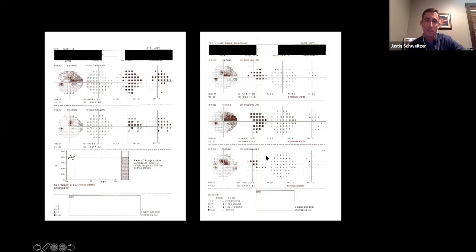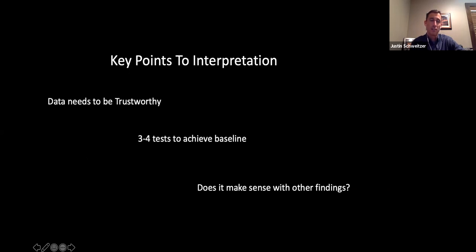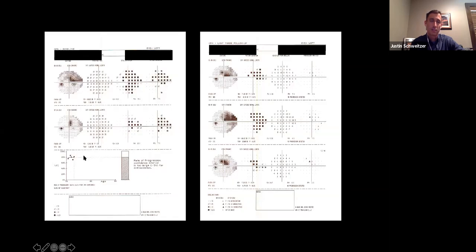And the time doesn't matter. In some patients, we may be getting them every 3 months because we're trying to figure out how aggressive is their glaucoma. Sometimes it takes years for us to get those additional 3. But once we get the 5 visual fields, then we get into this progression analysis graph, which is really nice. So you can see this patient has 5 visual fields, and their line, or that slope, is straight across. Okay, and I'm going to use a little different pointer here. So that line right there is straight across, meaning that patient isn't progressing.